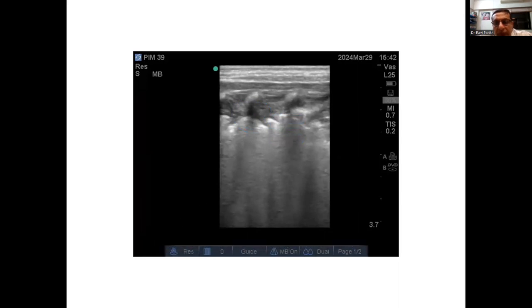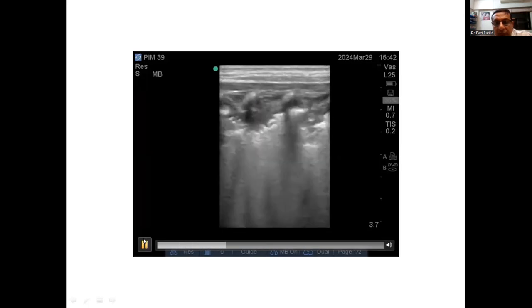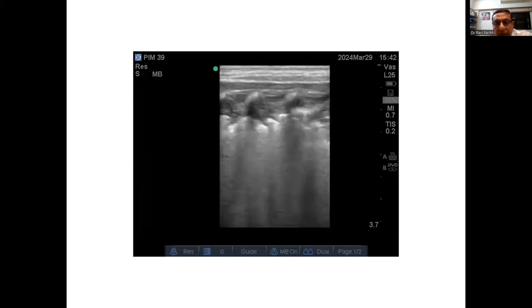Yeah, CRP was almost 115 for this baby. Had early onset sepsis also. So this linear bronchograms indicate what, sir? So they may indicate recruitability. We'll talk about it on Sunday.